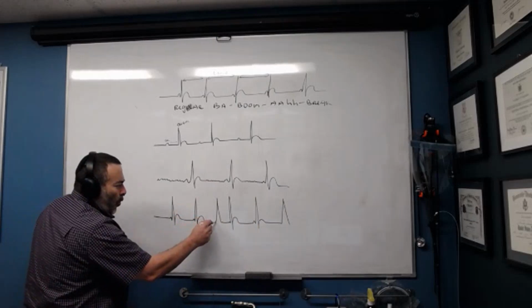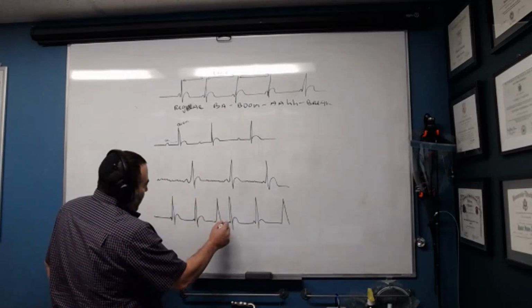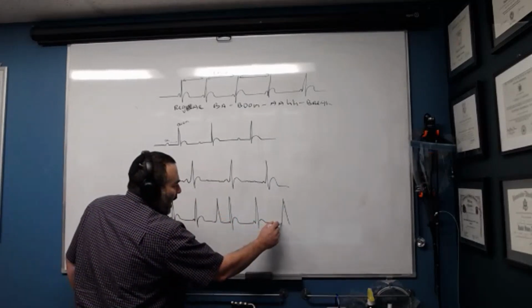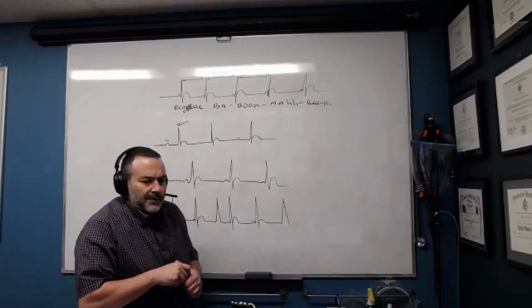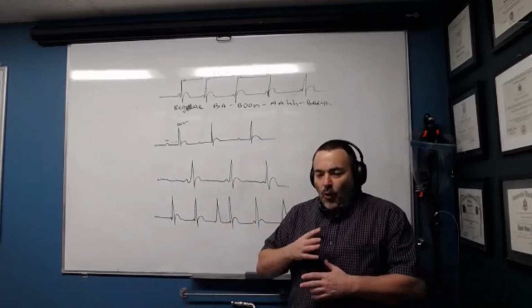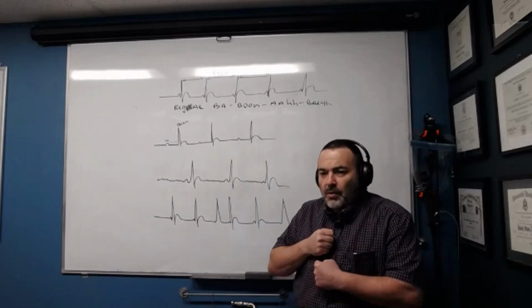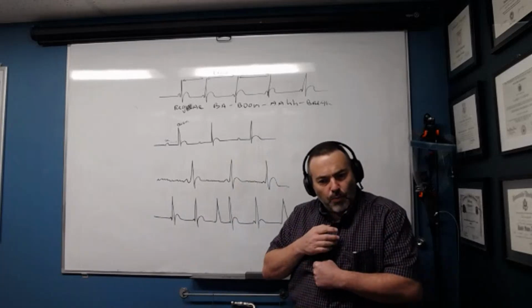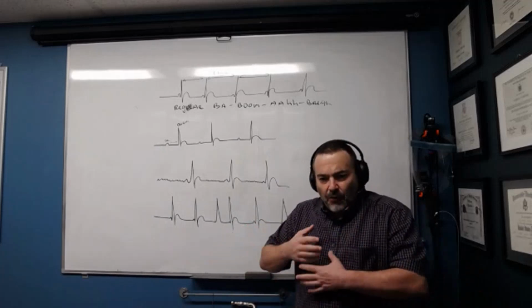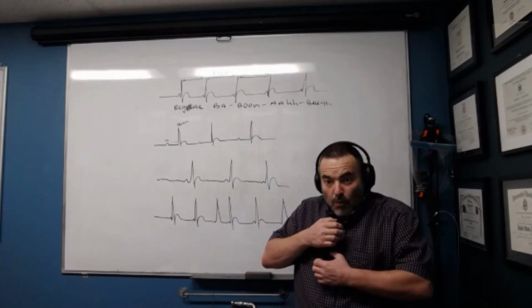And then all of a sudden, out of nowhere, there's another boom somewhere there. And we go back again, ba boom, ah, break. All of a sudden, out of nowhere, another boom. So in this particular case, somewhere abnormally, you got ba boom, ba boom, and then another boom out of sequence. There's no ba, there's just a boom. What happened? An extra beat from the bottom, an extra squeeze.